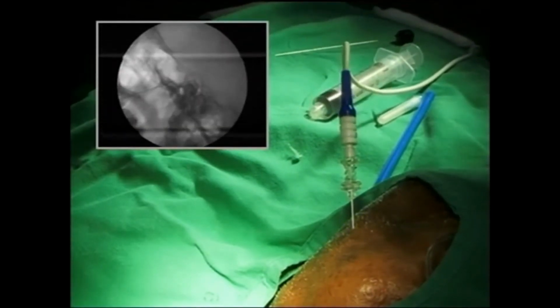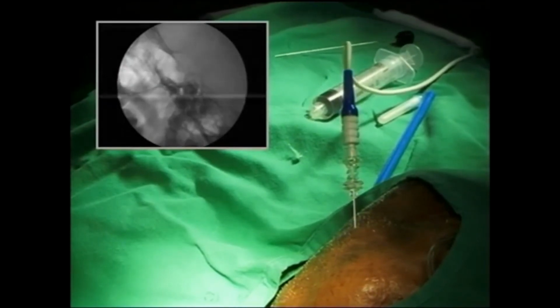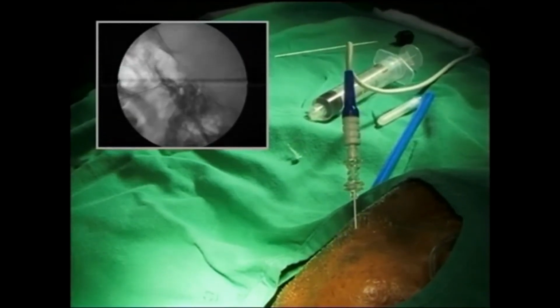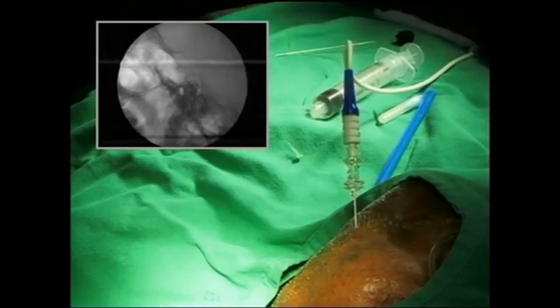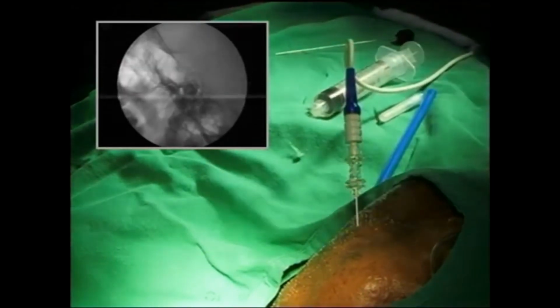RF machine. Some more? Okay. Motor is on. Can you show the settings? No motor. RF machine. Okay, stop. This setting right now, I've just stopped the motor stimulation. If you want to focus on the RF machine itself. Focus on RF machine. So the positioning is confirmed.